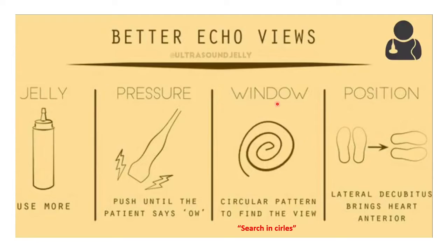Then to attain the window initially, it is suggested that you go in a circular pattern to find the best views. That is, you have to search in circles rather than tilting or sweeping.